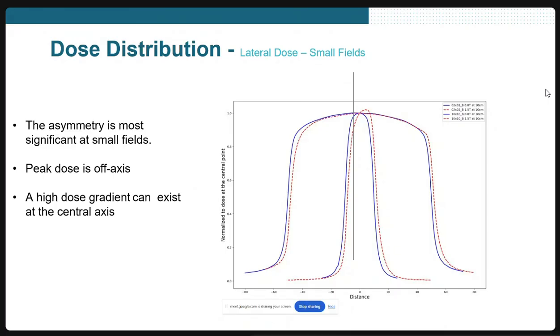But if you are able to reproduce that, then you can really do a Monte Carlo simulation of the fields, and then you can use these for the dose calculation. So whatever happens on the phantom is going to be the answer on the patient also. So you can really resimulate it and do it again.